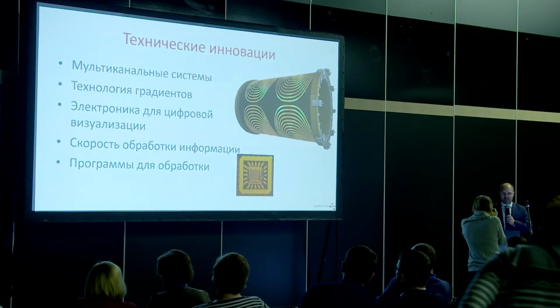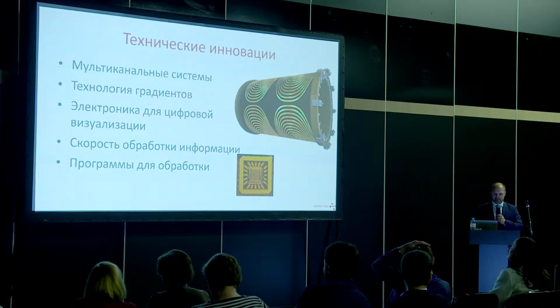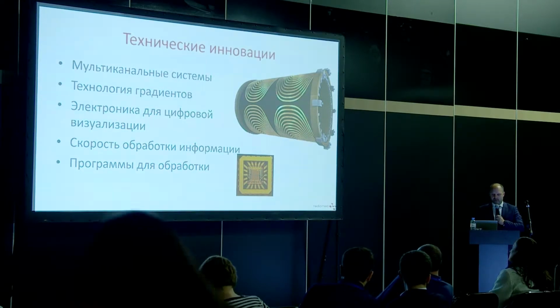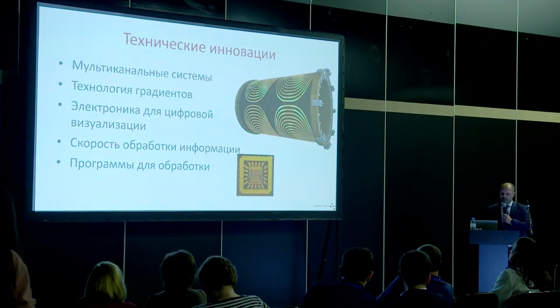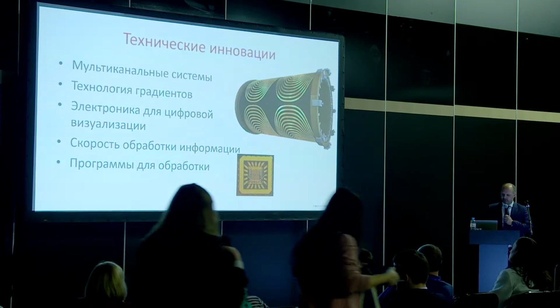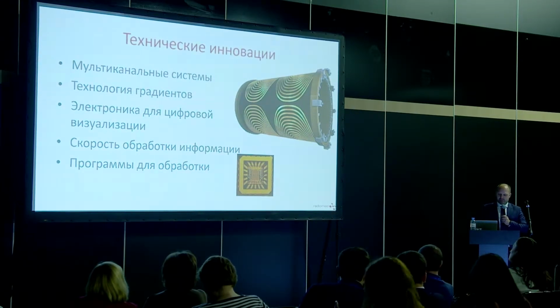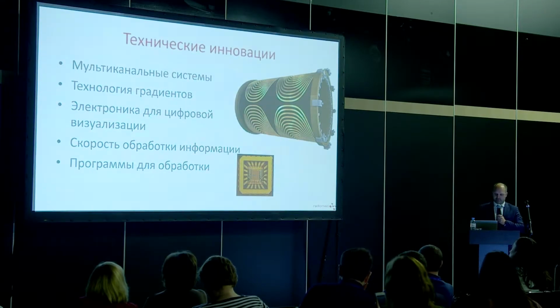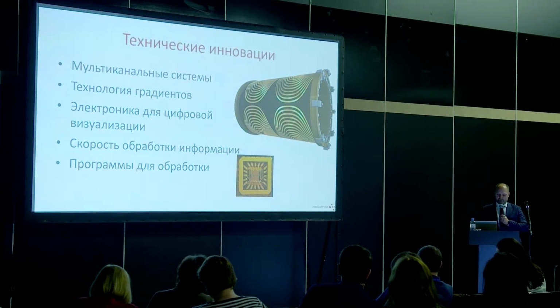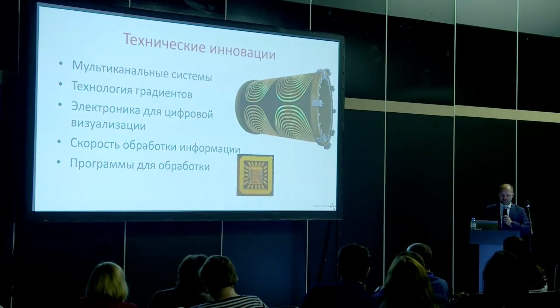From an engineering standpoint, recent innovations have been made in MR with respect to newly developed multi-channel systems, which employ total digital imaging and increasing the capabilities for parallel imaging, achieving very high signal-to-noise ratios. Newly developed gradient systems allow very highly efficient operation of the gradients, which gives room for energy savings while maintaining very high effective imaging parameters.